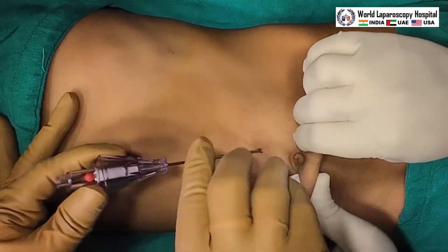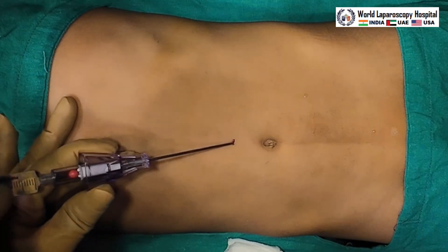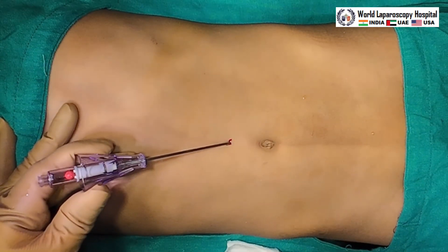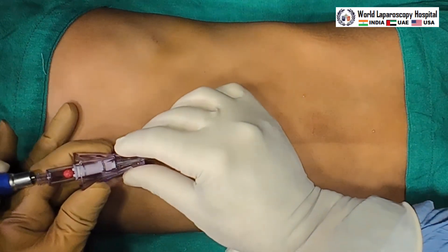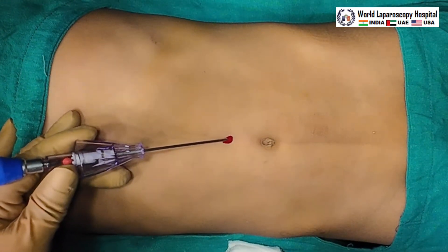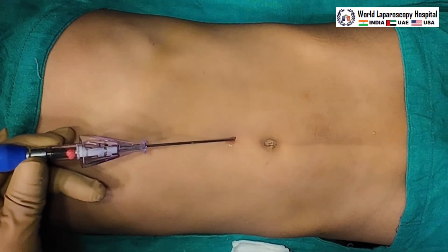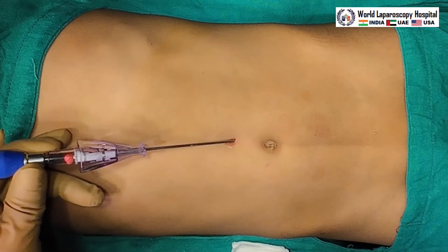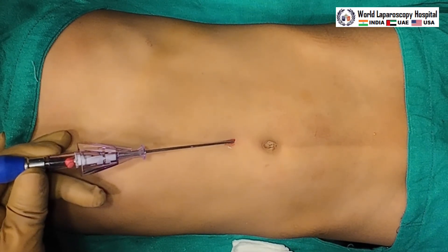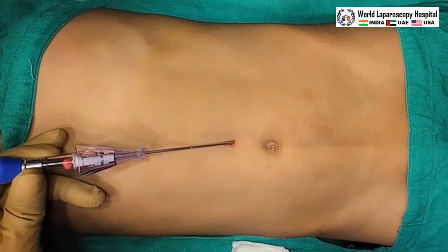The Veress needle has been introduced at the supraumbilical site. We are keeping preset pressure only 8 and the flow rate is 0.7 liters per minute. Suction, irrigation, and hanging drop test is done and now the insufflator is connected. We can see homogeneous distension of the abdomen has started. The amount of gas required in a pediatric patient is generally 200 ml multiplied by the age, so this patient will take approximately 1400 ml of gas, that is 1.4 liters, to achieve 8 millimeters of mercury.